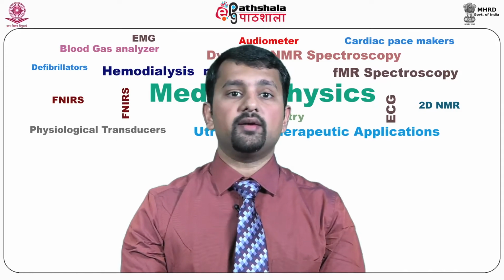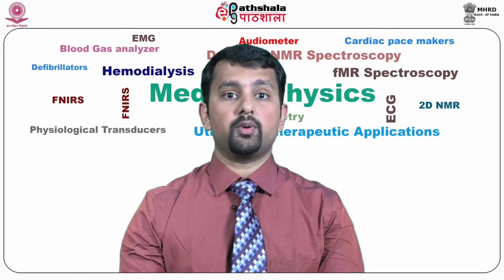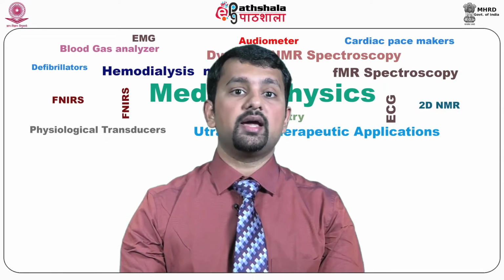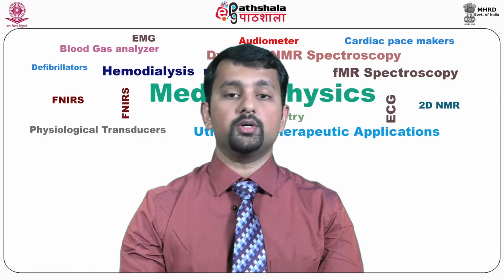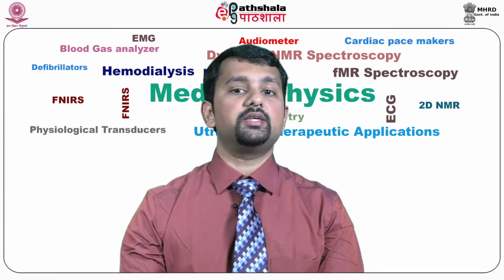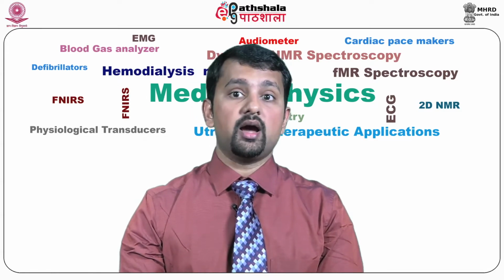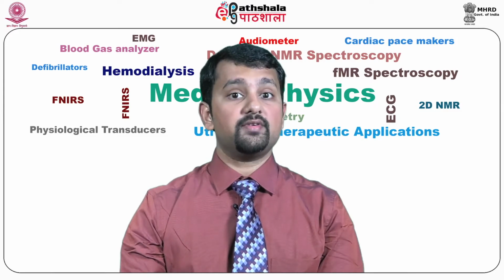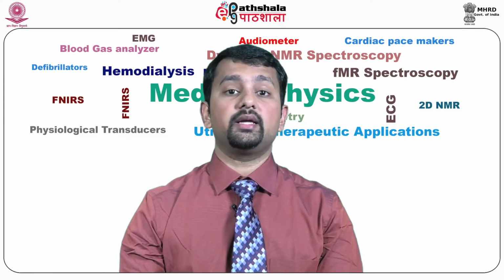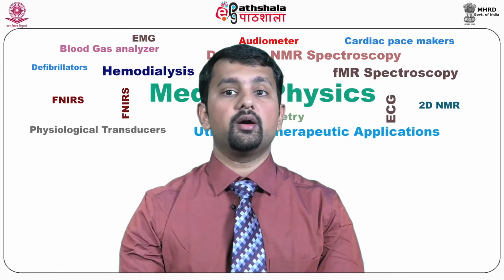The change in choline levels within 24 hours was significantly different between responders and non-responders classified with the response evaluation criteria in solid tumors, or the RECIST criteria, suggesting that the changes in choline within 24 hours after the first dose of drug can serve as an early indicator for predicting clinical responses to treatment.